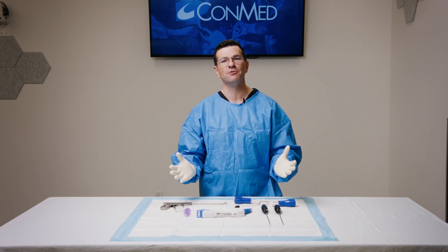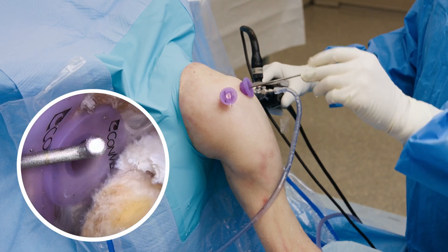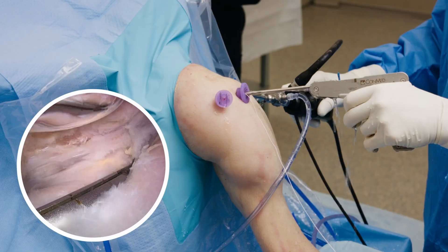Today, we're demonstrating a rotator cuff repair technique with a biobrace scaffold augmentation. For this case presentation, we're repairing this left shoulder rotator cuff tear and viewing from the posterior portal.